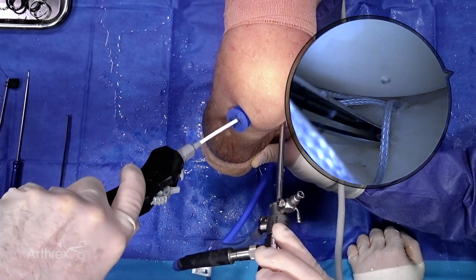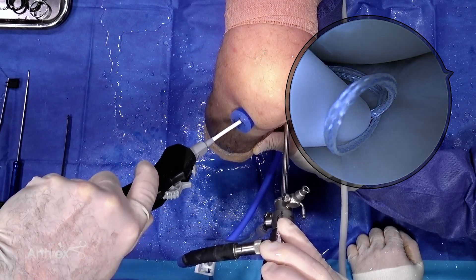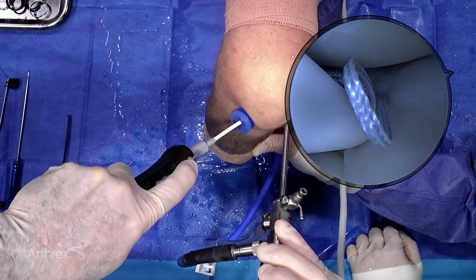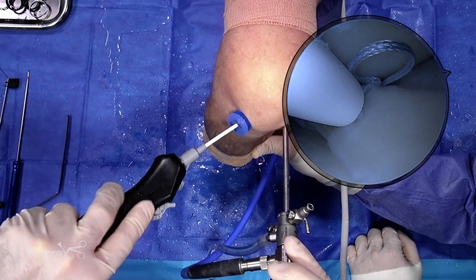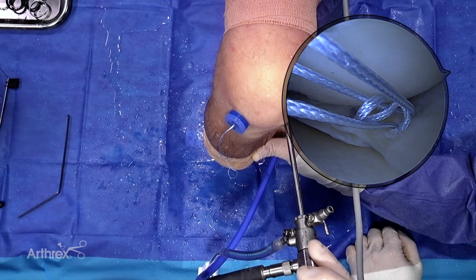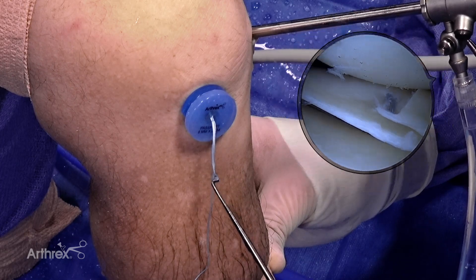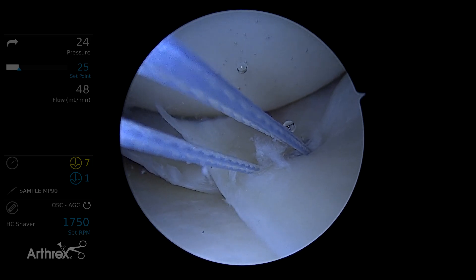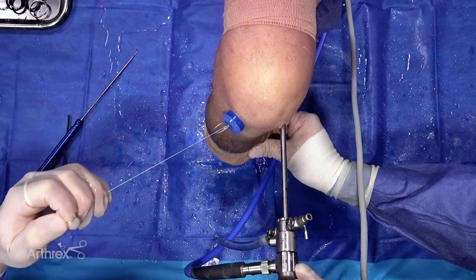I'm translating from front to back now. Doing the same thing with this anterior element — if it were displaced anteriorly, I'm using this suture to fix it to the capsule in a more reduced position so that our horizontal stitch in the end is just a finishing stitch. Backwards and all the way forward, hard stop. Pull that out carefully, straight out. There's our cross suture curled up in there that you can see arthroscopically. Outside the joint again we have a straight suture and a loop suture. I'm going to grab it at the end. The cross stitch is now tight, so the loop has done its job. Now I take the long single strand and deploy and tighten it down.